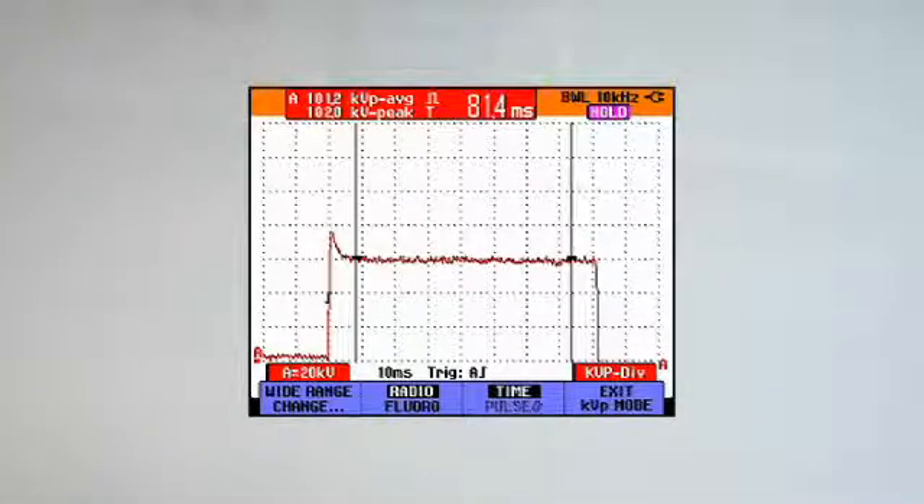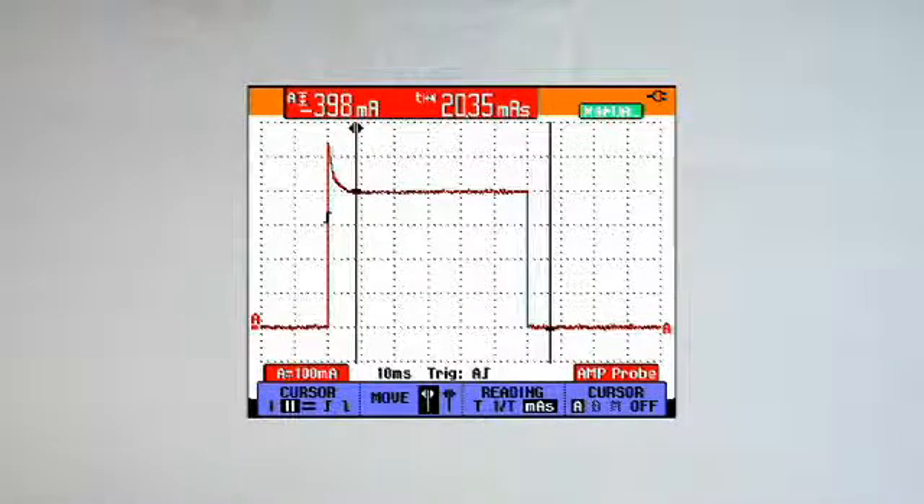It can display KV waveforms and digital readout of KV peak and KVP average simultaneously. The scope meter can also measure and display MAS values digitally, along with the current trace.